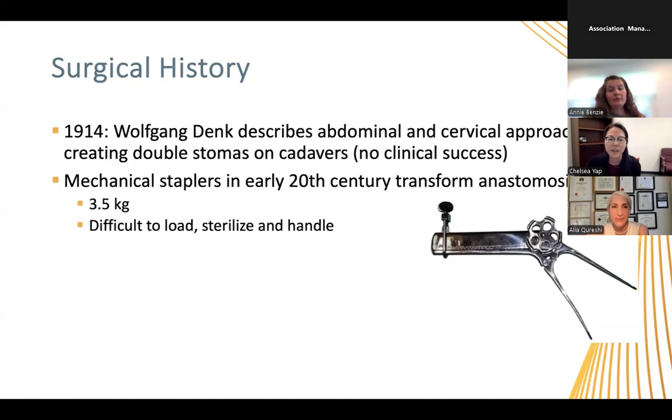And this is something that I found interesting: with the invention of the mechanical staplers, this really transformed surgery in general and also the esophagectomy. This first stapler, though, was actually quite heavy, 3.5 kilograms, so almost 8 pounds, very difficult to load, sterilize, and handle. So I just thought it was interesting to think about how the advances in technology, anesthesia, and postoperative care were all things that helped the esophagectomy get where it is today.